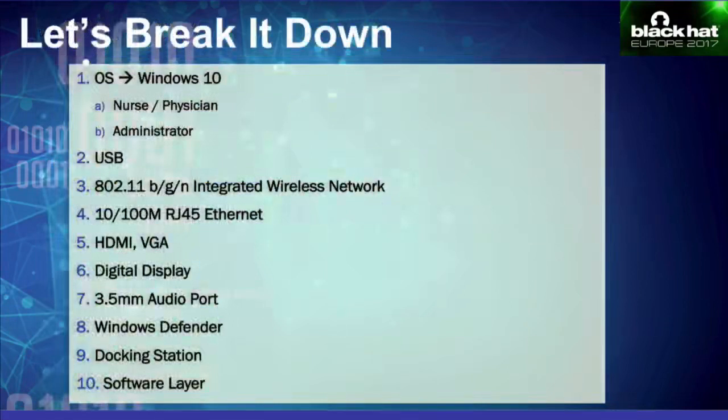Right, so it came with Windows 10 installed. There were two default accounts that we saw. One was a nurse/physician account, to be used by medical practitioners, and then there was an administrator account, which allowed manufacturers to remote into the device to perform remote operations. It exposed a USB port.